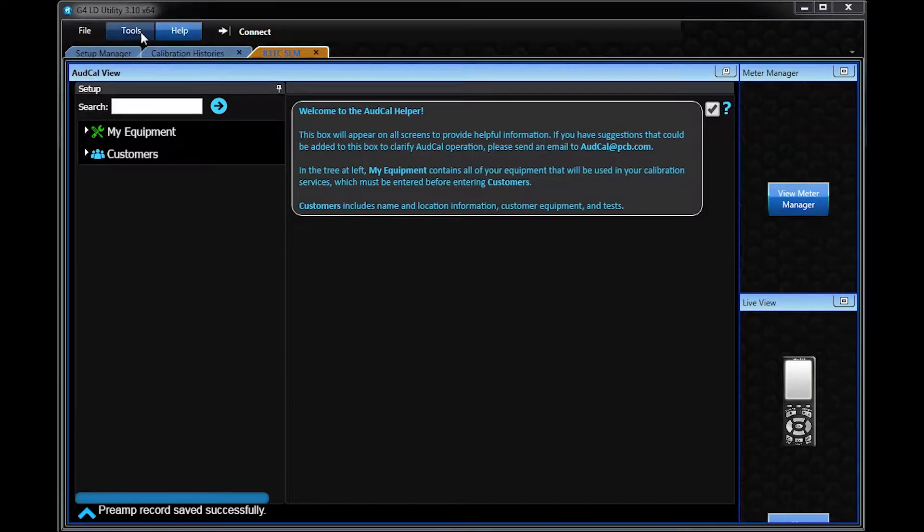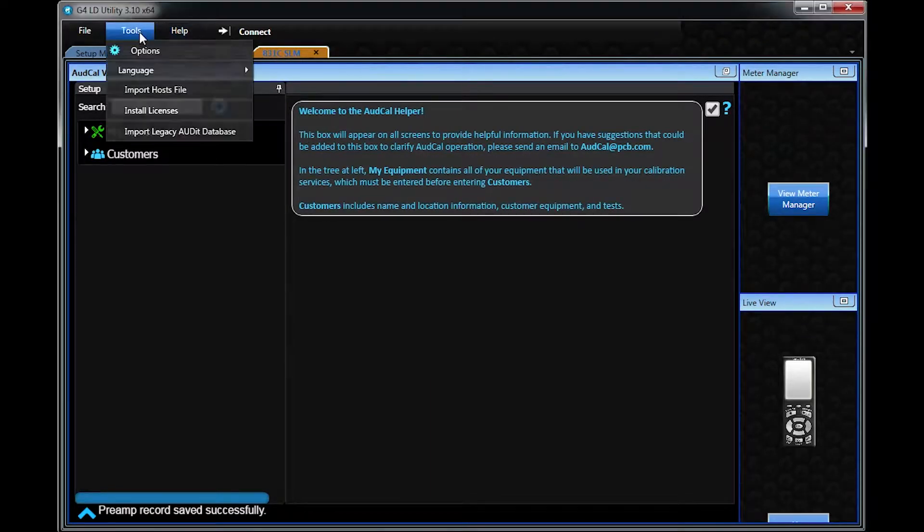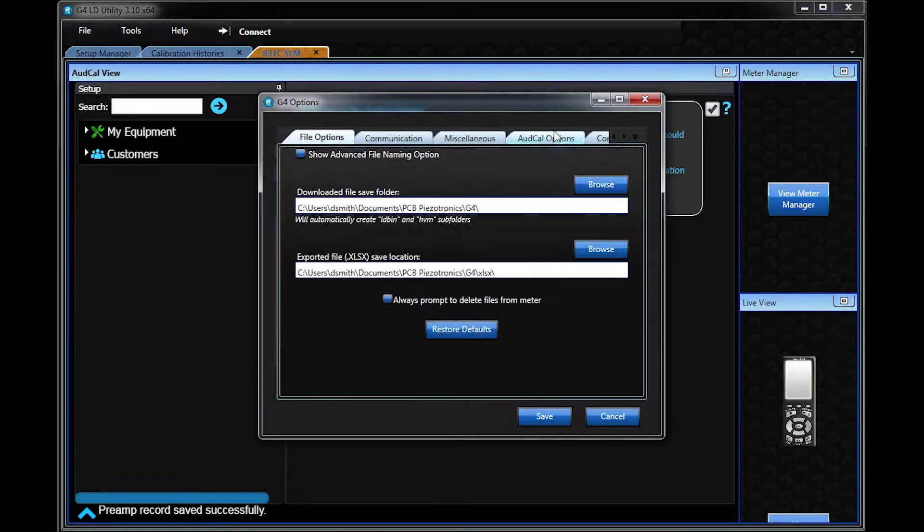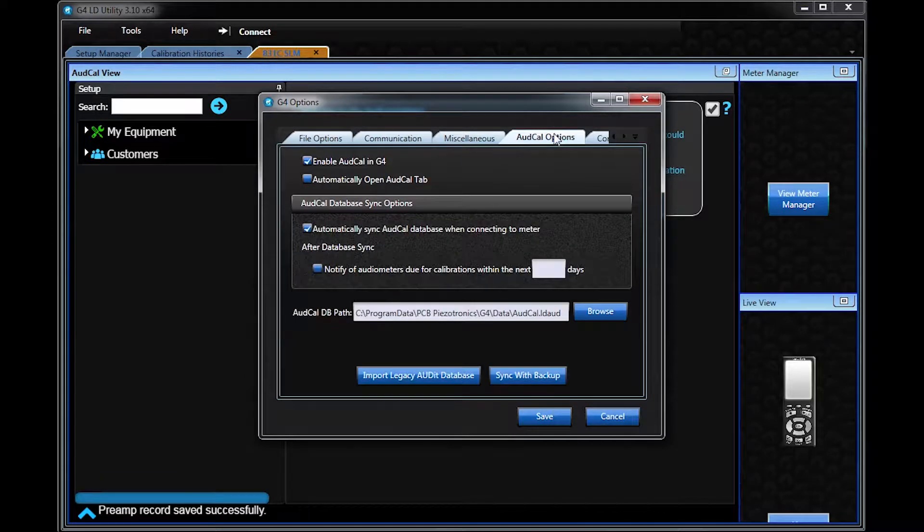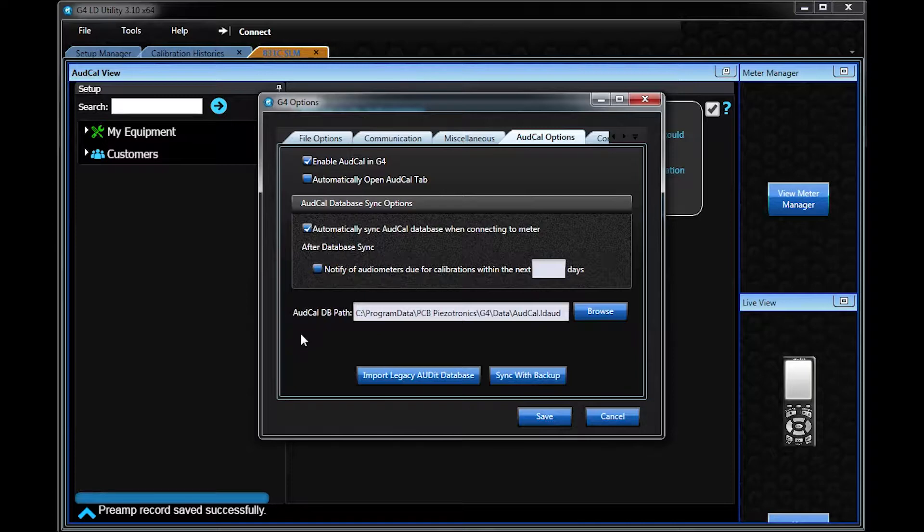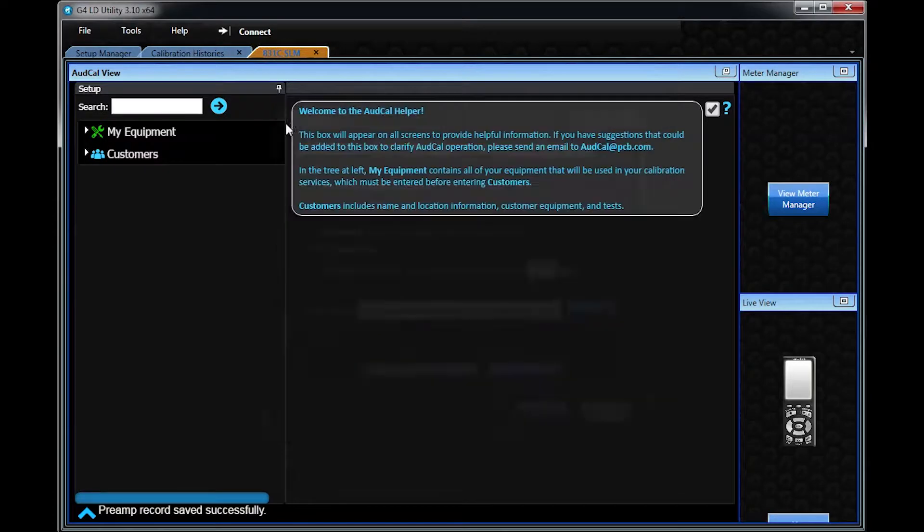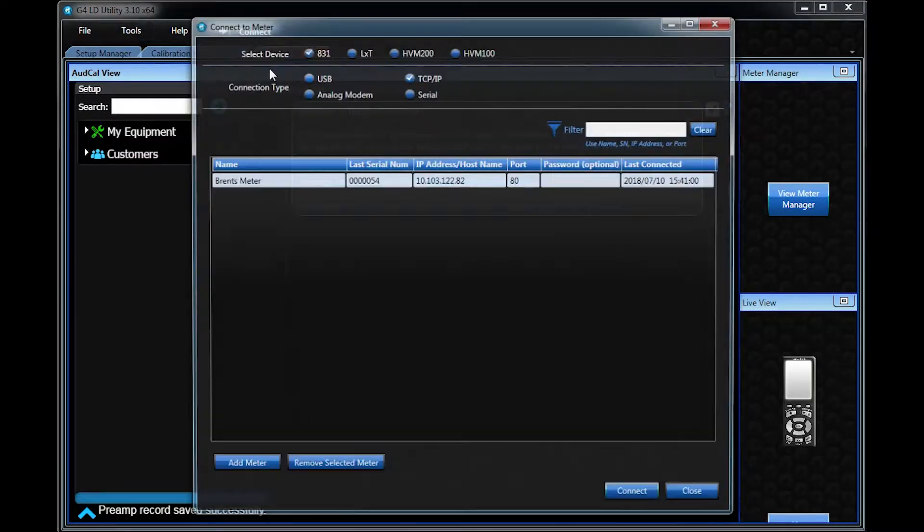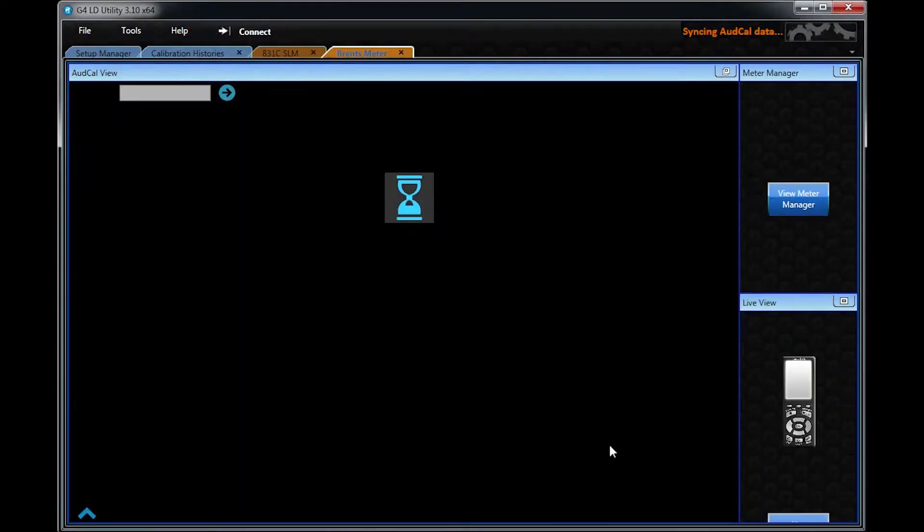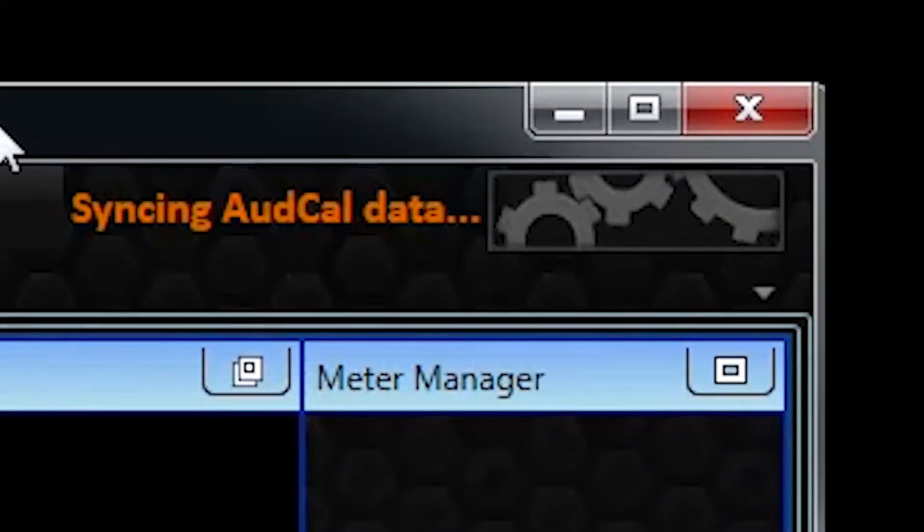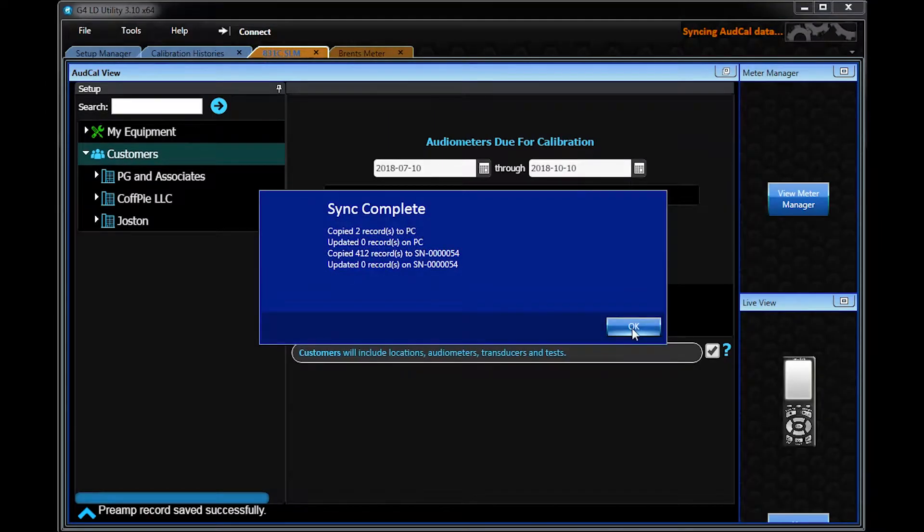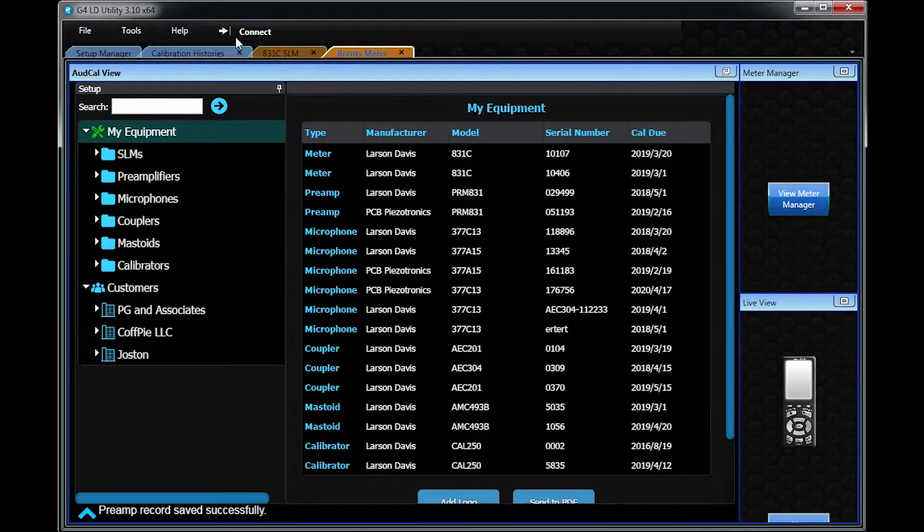To sync your meter to that file, go to Options and the AudCal Options tab. Selecting the Automatically Synced to Database option allows it so every time you connect to a meter, it updates the database with new information. If you connect a second 831C to G4, both meters will add to that database, making all the information available to both meters.